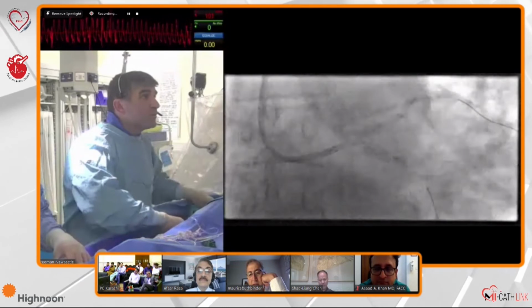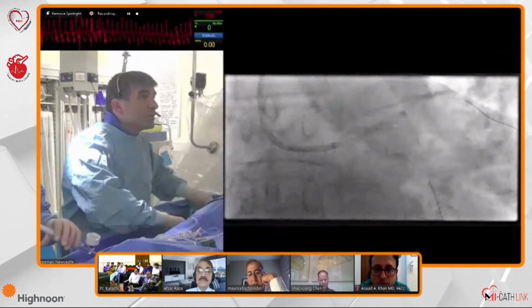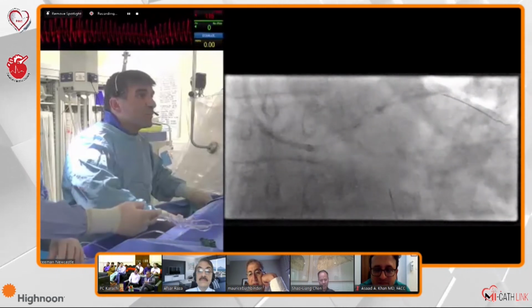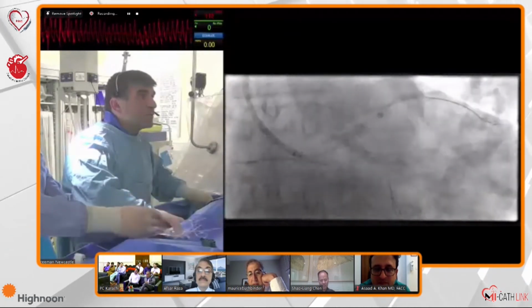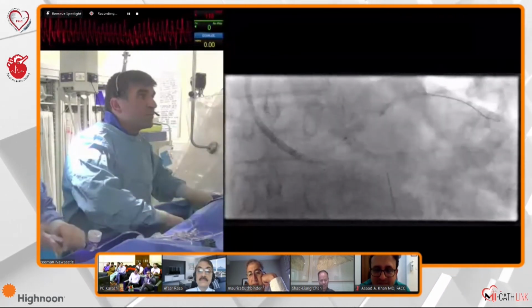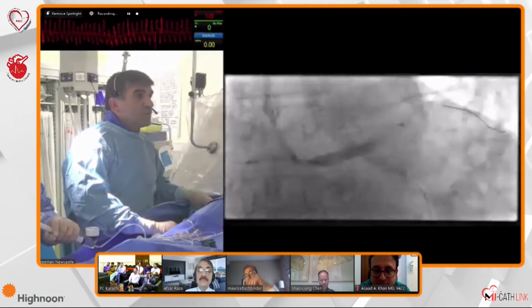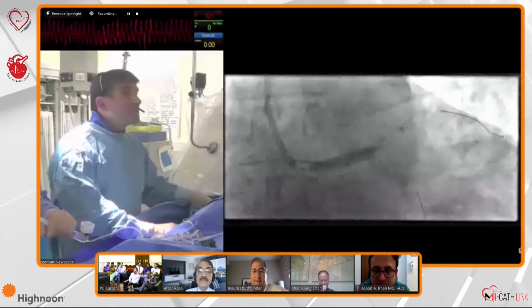But this is a 5.5. Okay, here we go. Just do it coaxial and we'll go up. I'll bring it back. Yeah, go up there. Go up. 12, 14, 16. Perfect. Store and down.